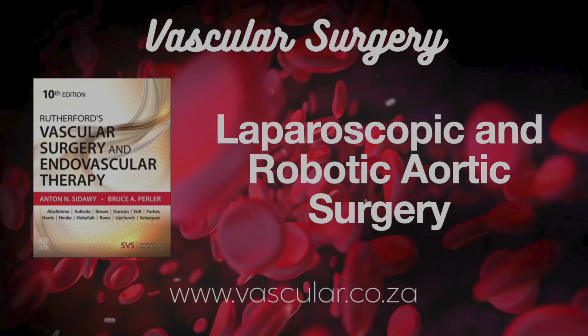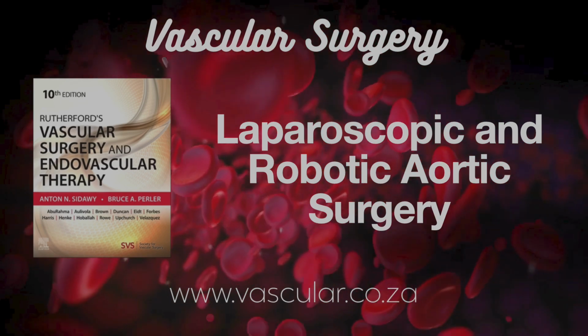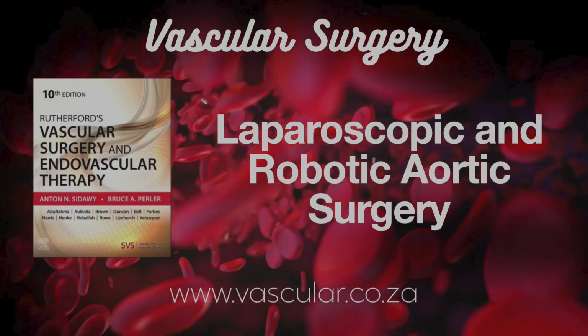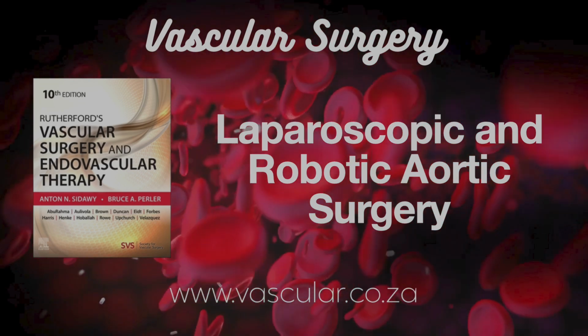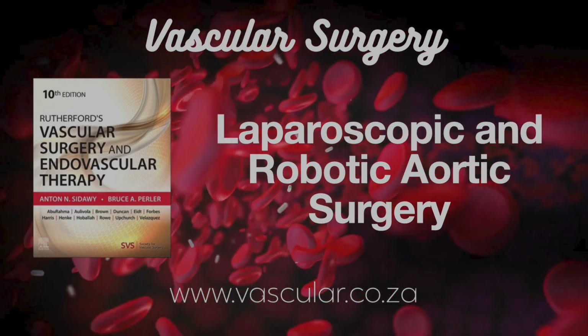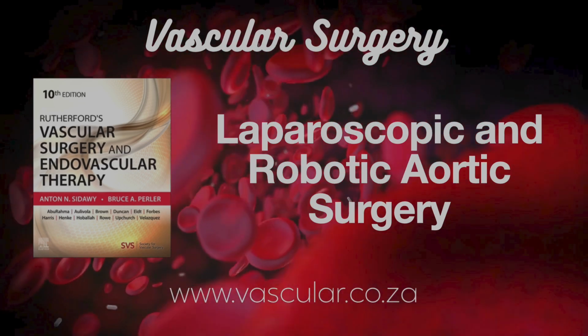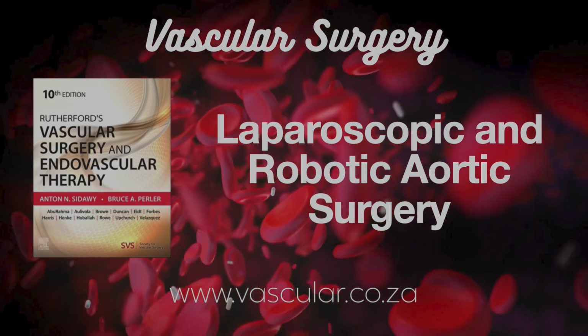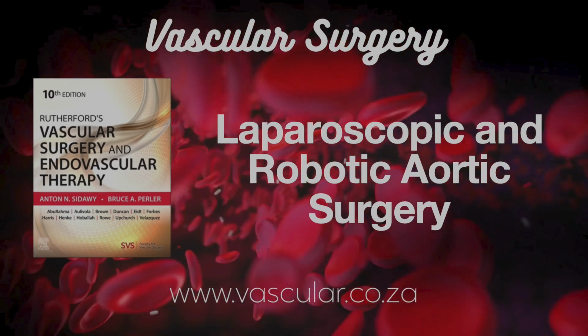Makes sense. What tools do the robots use? Common ones are monopolar scissors for cutting, bipolar forceps for grabbing and sealing vessels, and they use different angled cameras, endoscopes, usually 0 and 30 degrees, to look around corners, essentially. Okay. And can they do those same approaches we talked about before? Yep. Both the retrocolic prerenal and the retrorenal approaches can be done robotically.